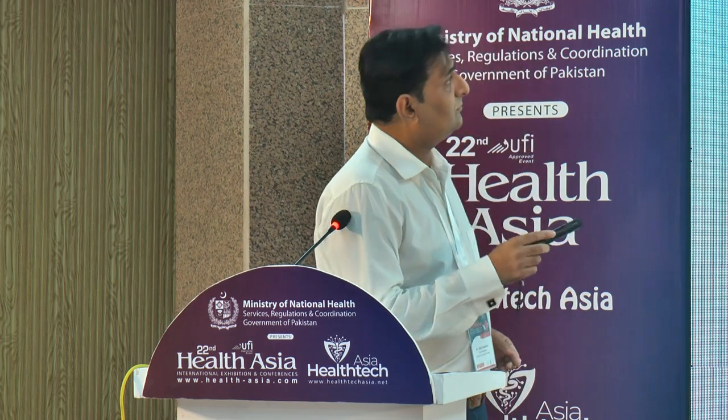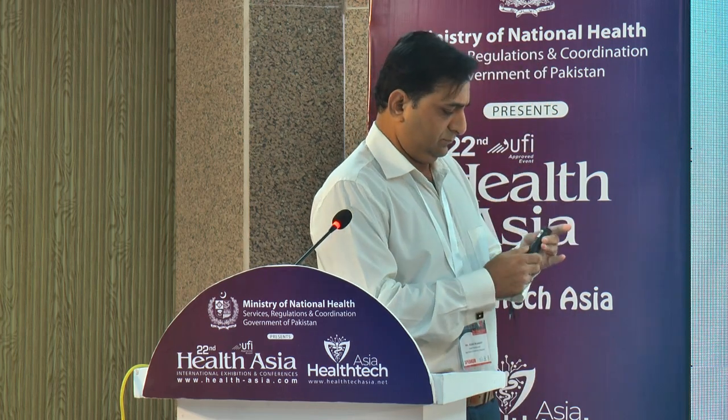Here we can see the diagram of the aorta. Ascending aorta, aortic arch, and descending aorta, and a few arteries arising from the aortic arch. Normally we insert the aortic cannula into the aortic arch, right?